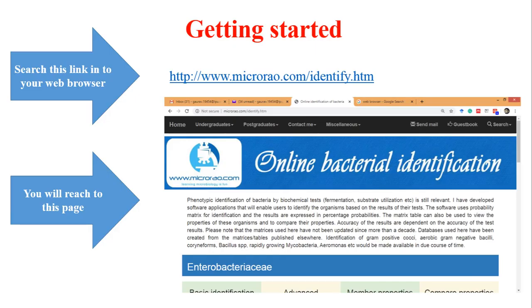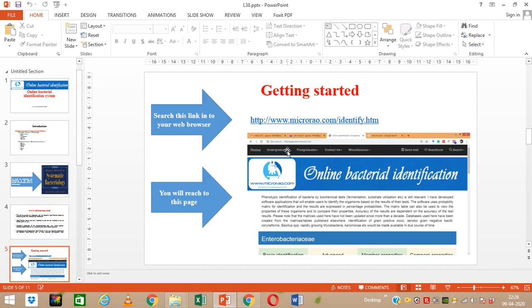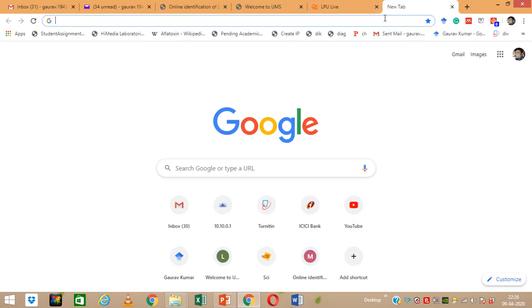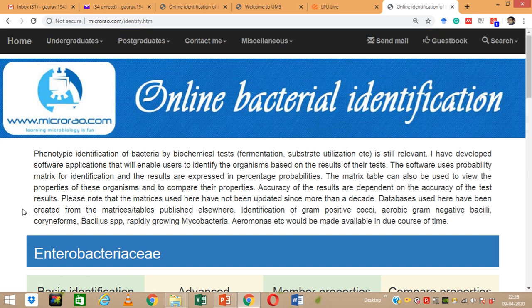Now, how to use this software. The link is http://www.micro-rao.com/identify.htm. You copy this and put it into your web browser and search for it. You will open up a page, and I am just copying it from here and putting it into my web browser, landing on the homepage of this particular website. Brief information about this application has been given there.